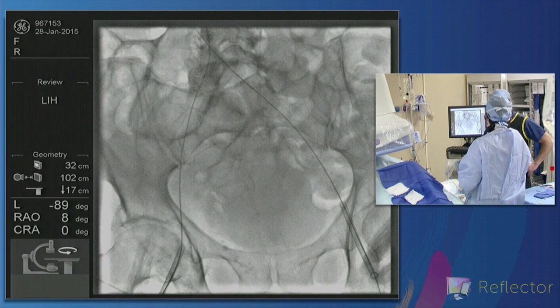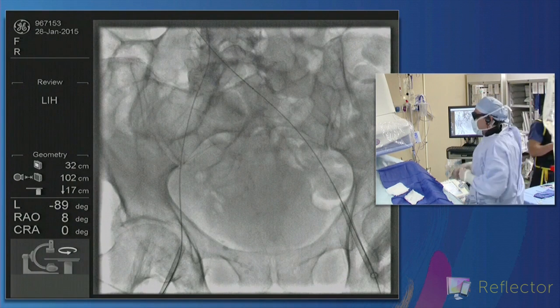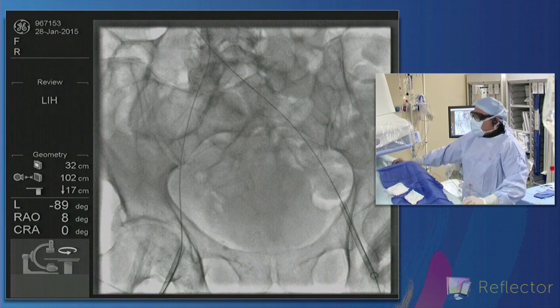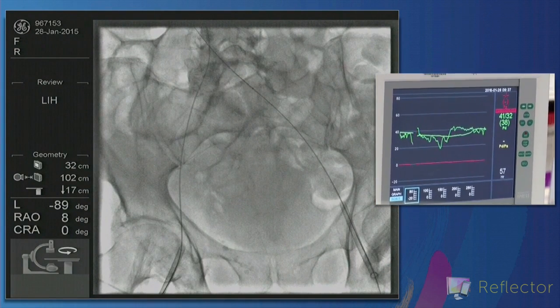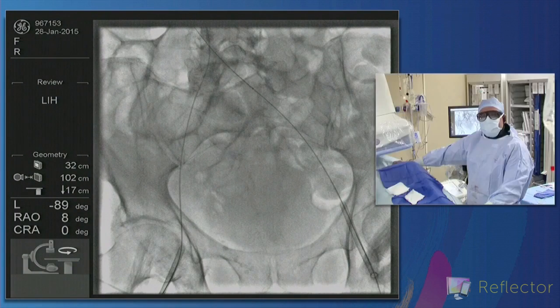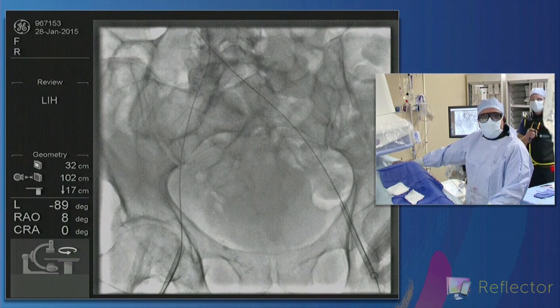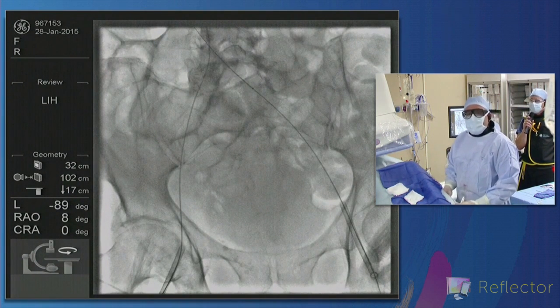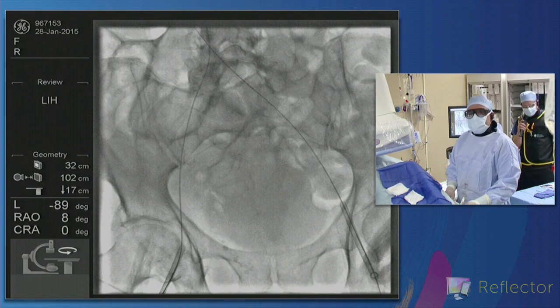So, Kevin, you're doing a pressure wire there? Was that what you were doing? Yes, we did the pressure wire, and based on my understanding, there should be a change of 2 to 3 millimeters of mercury if there's a critical venous stenosis as part of high venous pressures. In the IVC, we had a mean of 3, and right through the stenosis, we had a pressure of 6. So that was the increase of 2 to 3 millimeters of mercury, suggesting again that this external iliac vein stenosis may be contributing to this patient's severe disease. Okay, so I'm going to go right to the next case.